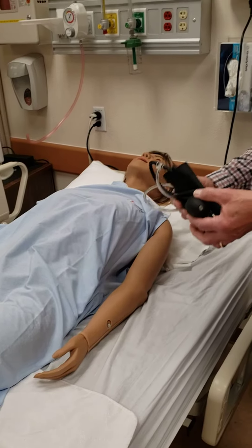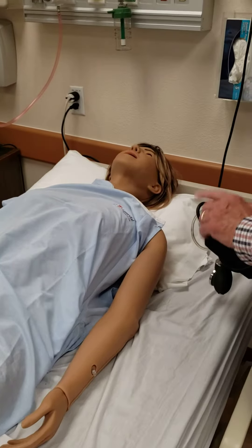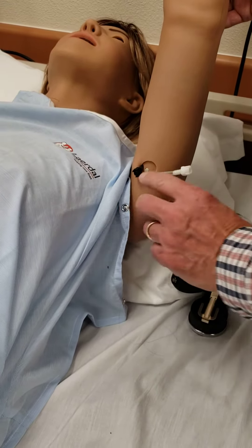For this video, we're going to show you how to connect the blood pressure cuff to do a manual blood pressure on the mannequin. It only connects to the left arm, and on the left arm, if you lift it up, you will see there are two connector devices here — a black and a white.